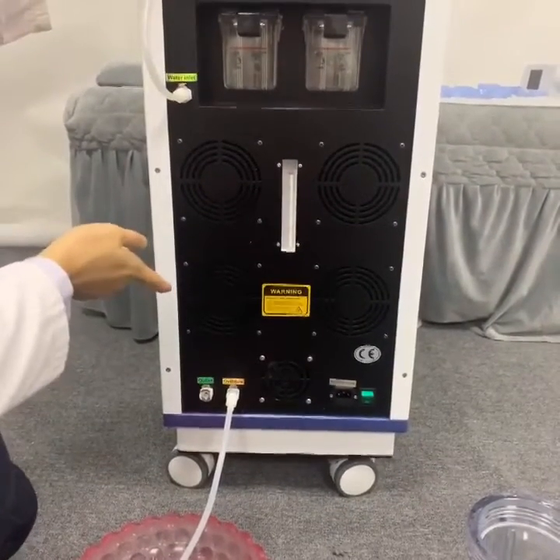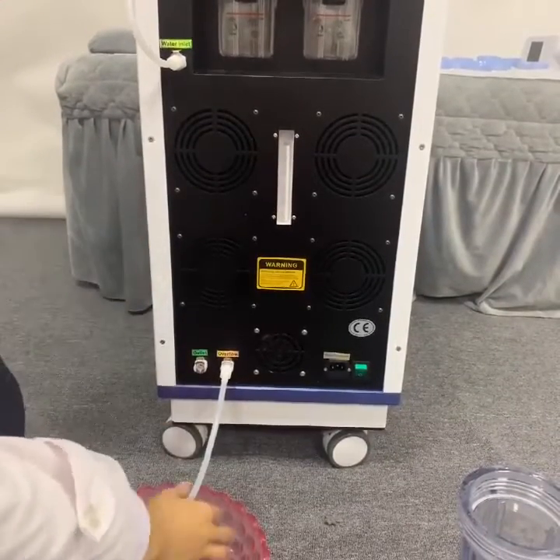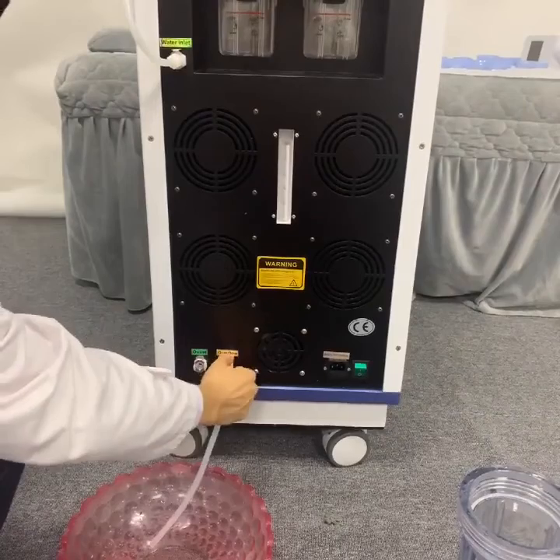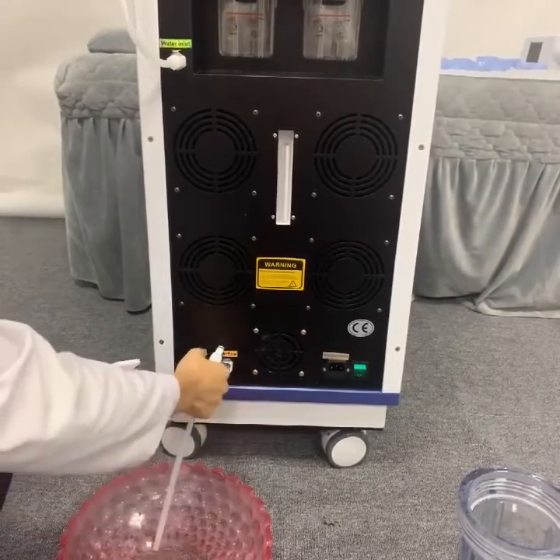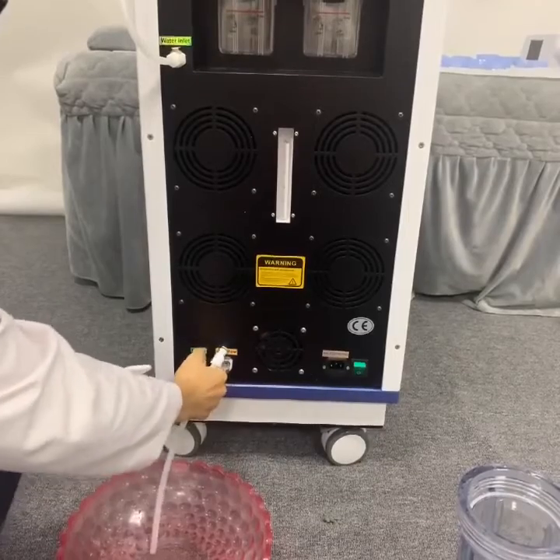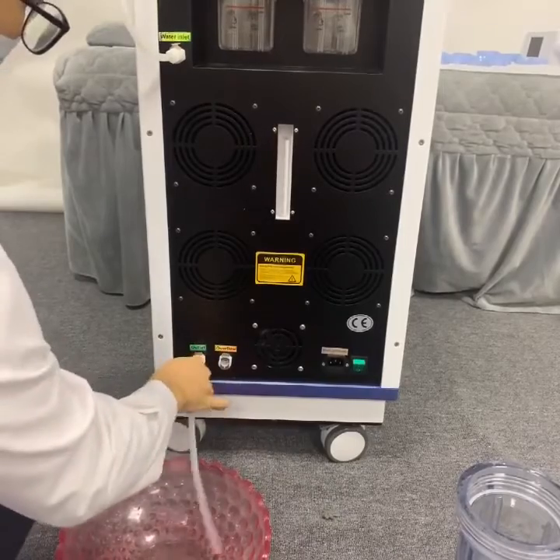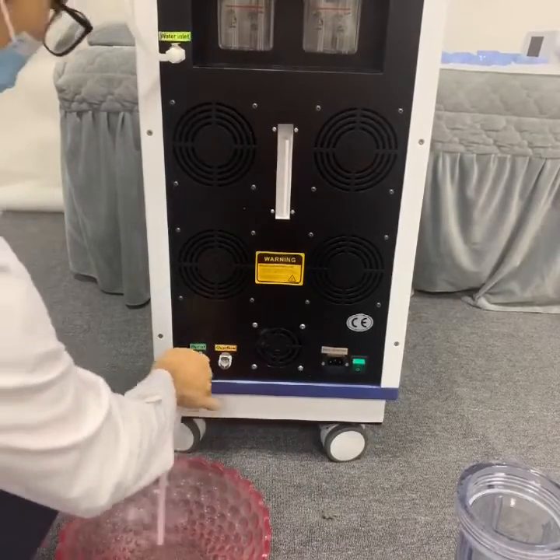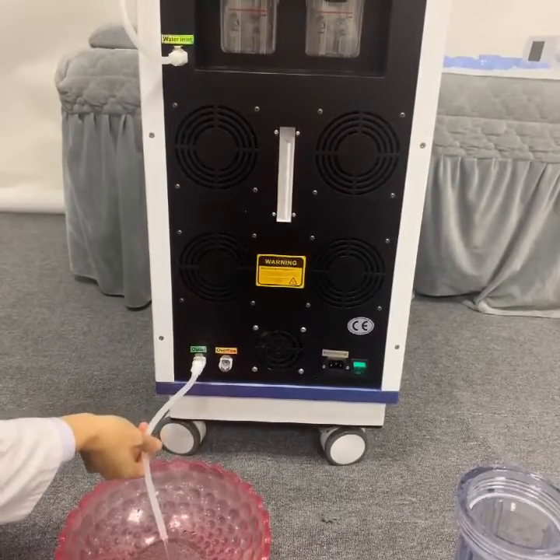When you don't want to use this machine anymore, we have to release the water inside. We have to use this tube and insert it to the water outlet hole — the same operation. Press the silver button and then insert the tube. Then the water will come out from the water outlet hole.